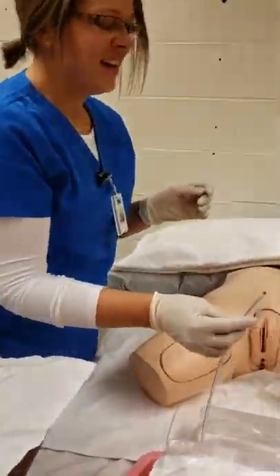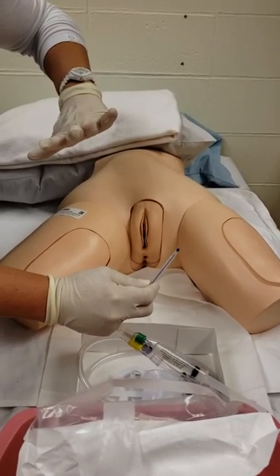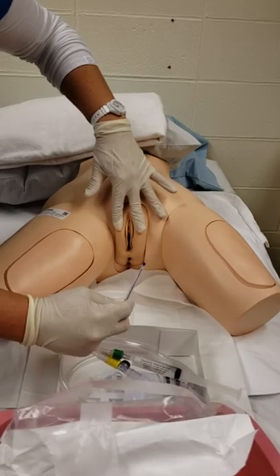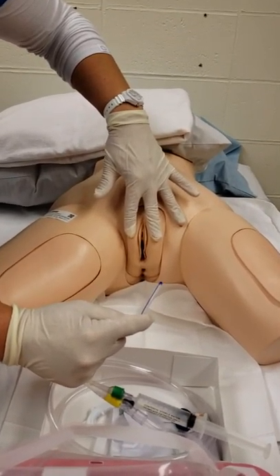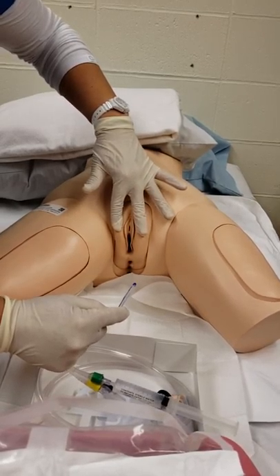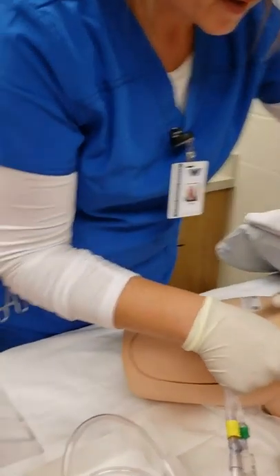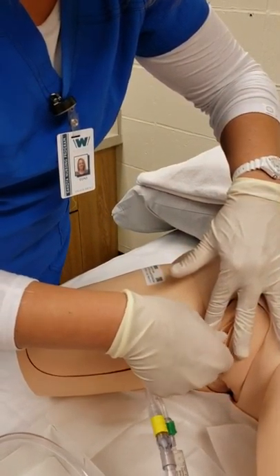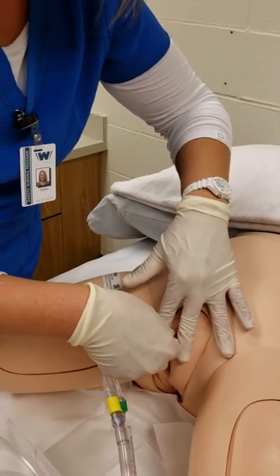I coil the catheter in my hand so it doesn't leave the sterile field. With my non-dominant hand I spread the labia open. I instruct my patient to bear down and breathe out her mouth like through a little straw. On the count of three I begin inserting: one, two, three — inserting slowly. I continue to insert until I see urine coming out, and then at that point I insert another one to two inches.